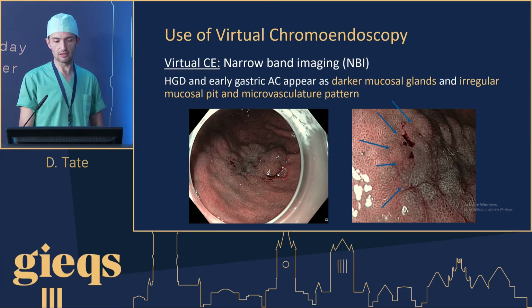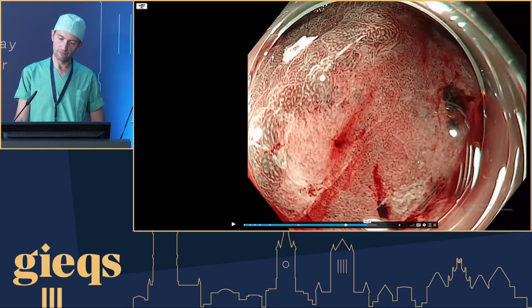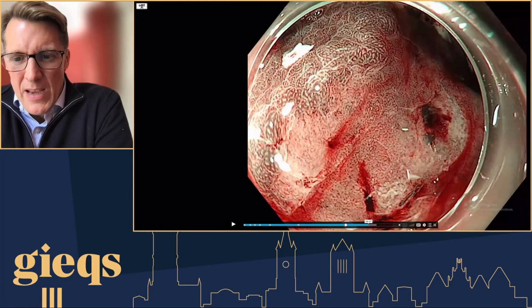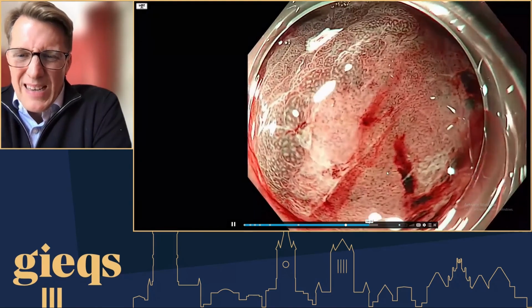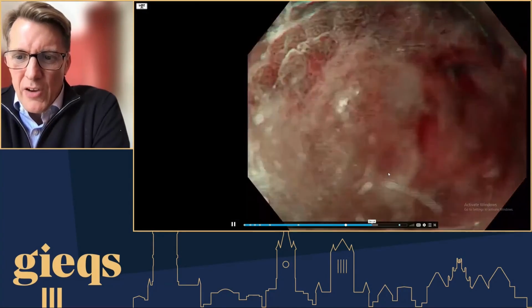This is a lesion. You can see a demarcation line nicely observed also in Raf's live case, in the live case I just did. You can almost argue there's a demarcation line in Michael's case. So just on the junction of the antrum and the corpus, what you can see there is a beautiful demarcation line. In the center of the lesion, you can still see some vasculature, but it's reasonably well organized, but to me that looks like at least high grade, if not intramucosal.